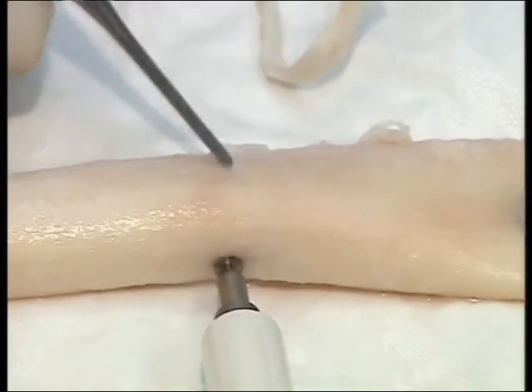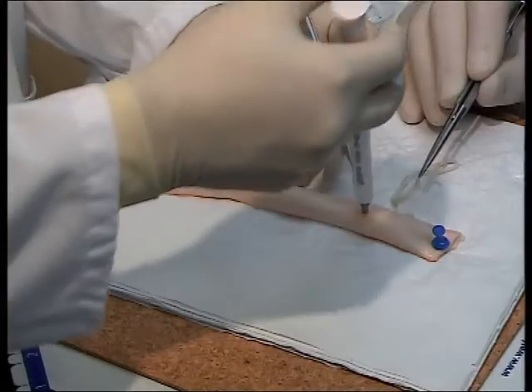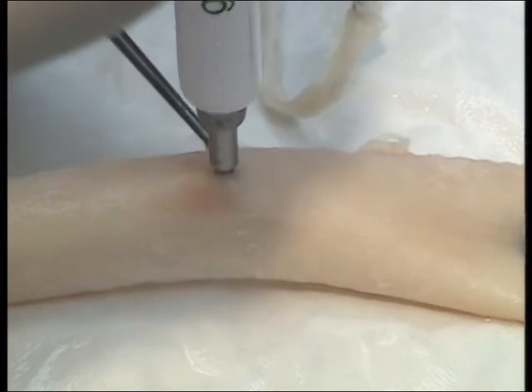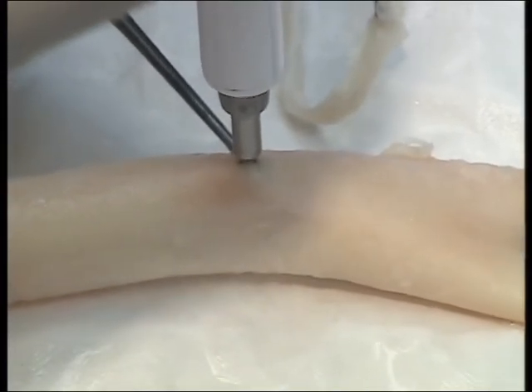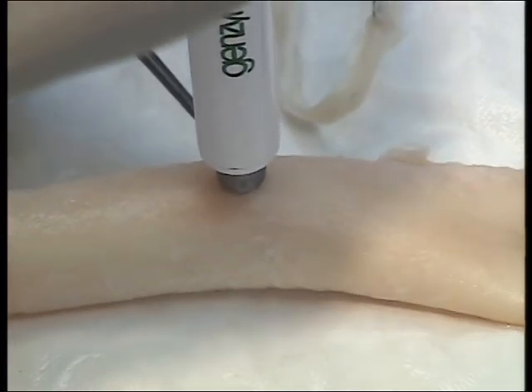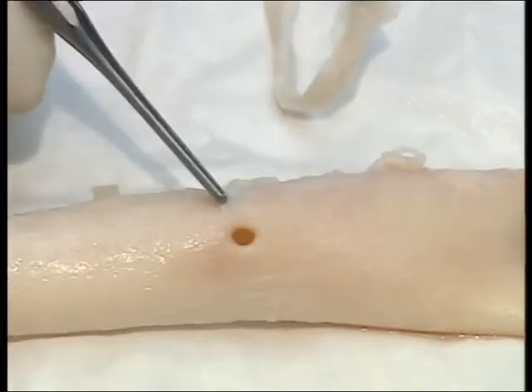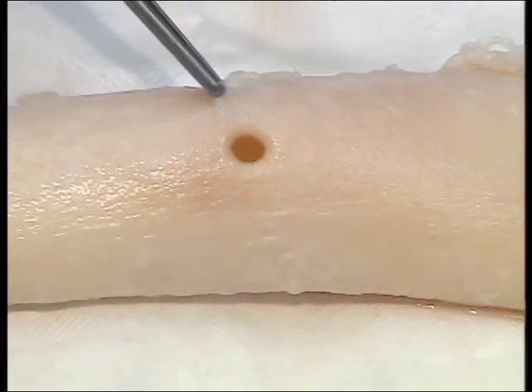Introduce the aortic punch edge first into the incision. Pull up on the punch without dislodging it, and engage the punch to create a circular, smooth hole.